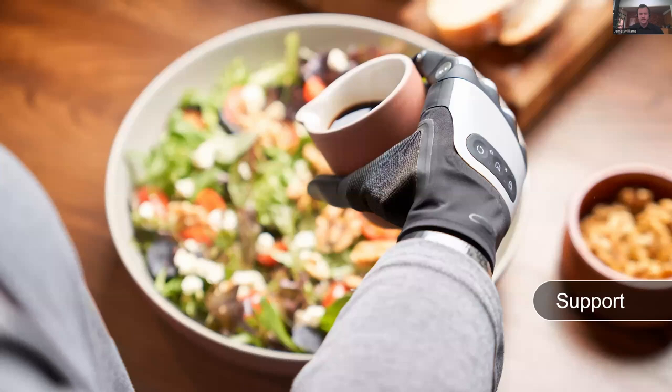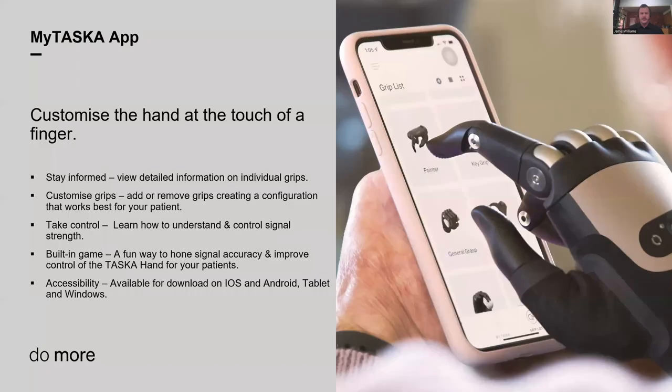Finishing up with our support. The MyTasker app is available on mobile, tablet, and Windows. Clinicians and users also use the same app — if you're a clinician, make sure we know about you by signing up to the TLA or registering yourself as a clinician in the app. Once we approve you, you'll have access to the clinician features. The app is used to configure the hand, change settings, and customize it for your patient. It's also got built-in games so you can practice signal separation and work on myoelectric control.